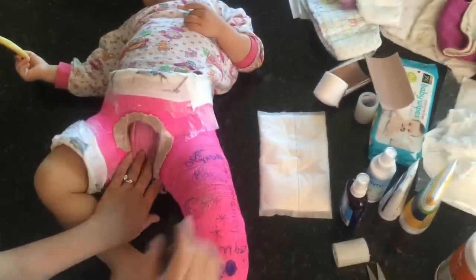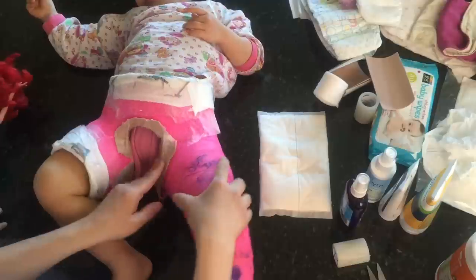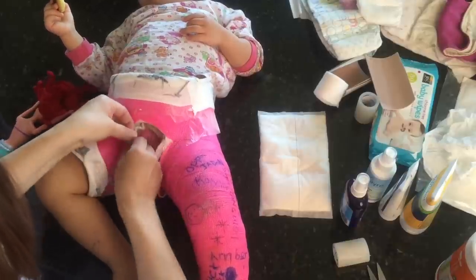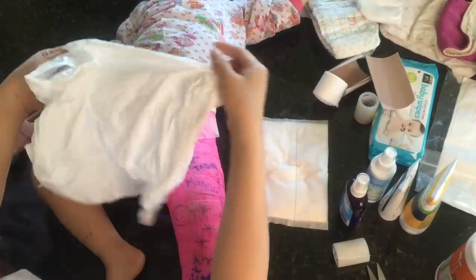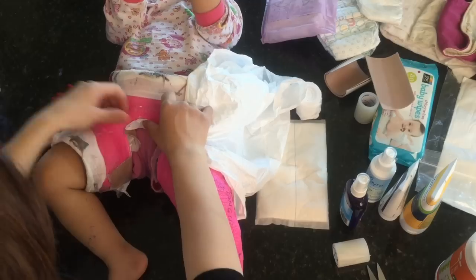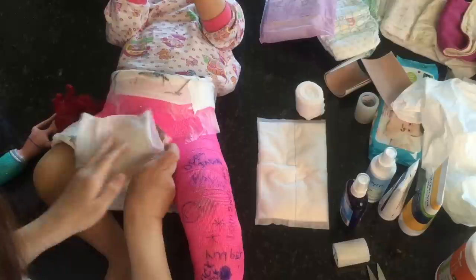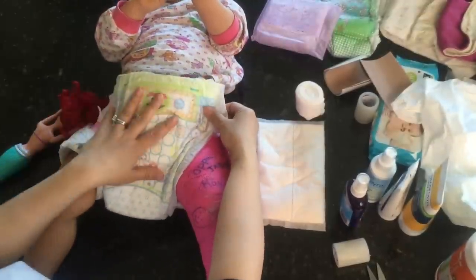I have this cloth covering her private parts. When you first bring the baby home from the hospital, you'll see a gore-tex material wrapped around with a little hole for going to the bathroom. The hospital told me to put an infant diaper inside and get a size six diaper to go around the whole cast to catch extra mess.